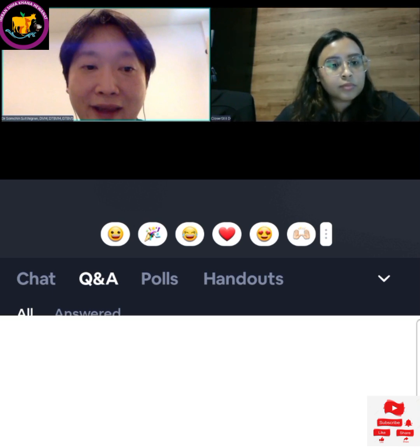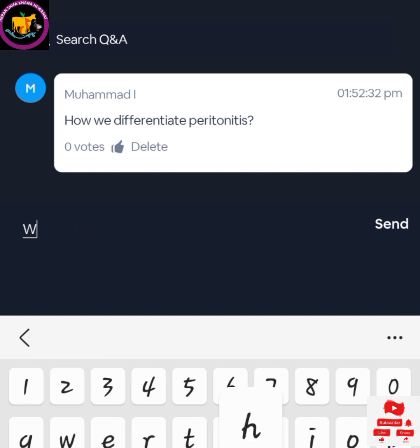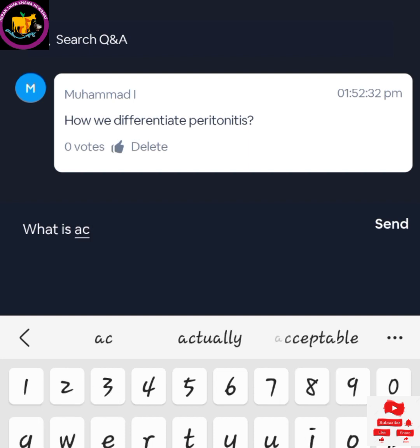Okay, understood. Okay, for the next question, coming in from Monica, what is the best approach to rule in and out free fluid in an emergency? Okay, please, I'm not hearing. Okay, what is the best approach to rule in and out free fluid in an emergency?